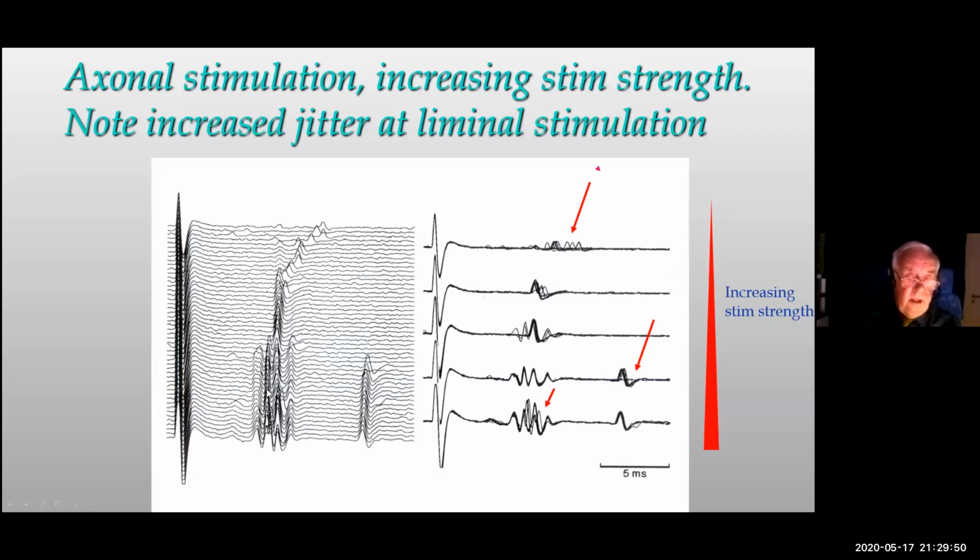You have, like a hawk, to concentrate on one of the spikes and check that it has a good stimulation. And particularly if you have a patient with myasthenia with a lot of jitter, then you have to increase the stimulus just very little. And if the jitter becomes normal, then it was not a problem. But if the jitter does not change in myasthenia, then it is a real true myasthenic problem.